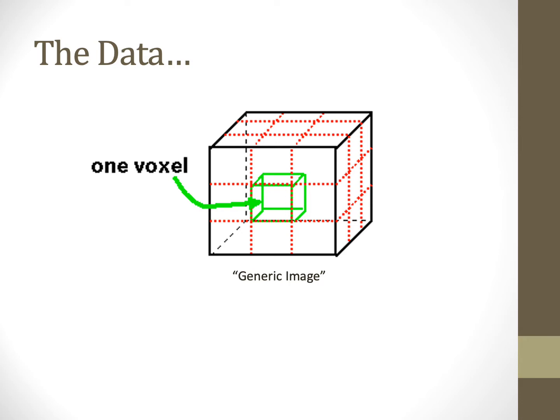But what is an image exactly? Really, an image is simply a matrix of different pixels that have different values or intensities. In reality, because our pixels in our MR images have units of length, and because our MR images are 3-dimensional, each pixel is actually a volume element, or voxel, as seen here in the green box. We will refer to individual pixels as voxels throughout the course.